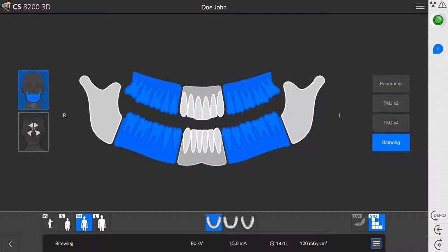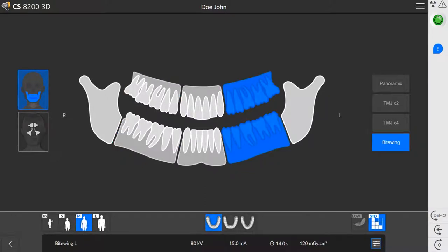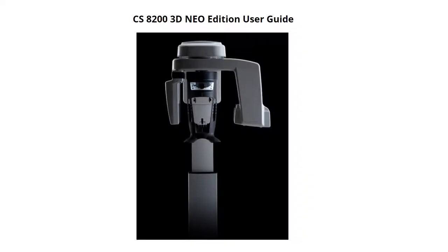You can select both bite wings or you can select the right or left bite wing. To perform a maxillary sinus exam, click Sinus. For an explanation of the radiological exam options, see the CS8200 3D Neo Edition imaging system user's guide.